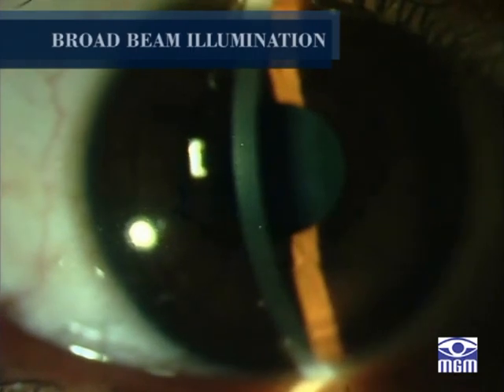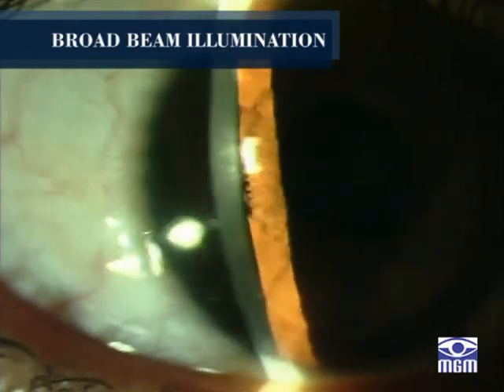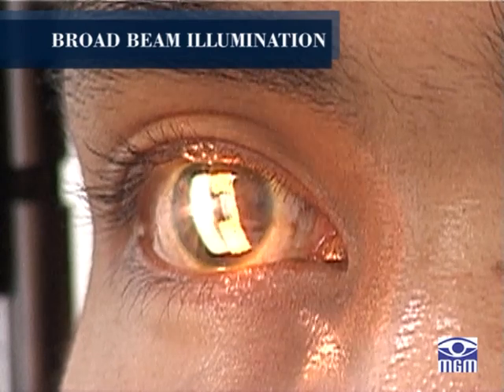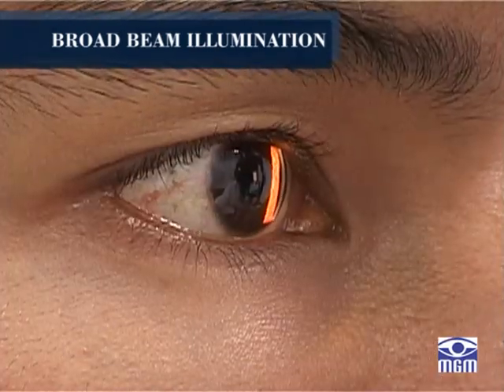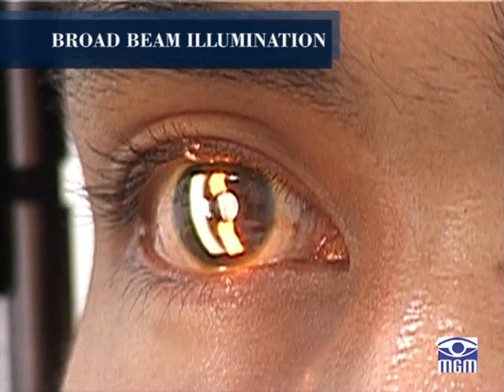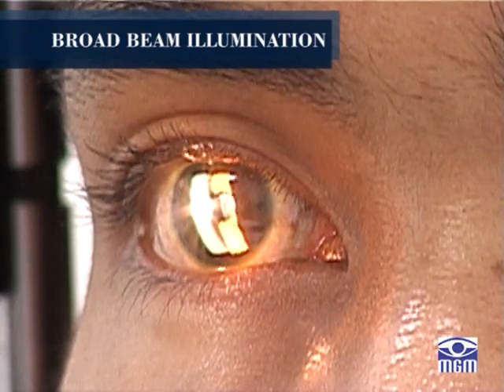Broad beam illumination, the term broad beam is variably used. Here, the beam width can vary from a width of 1 mm to its full size of approximately 11 mm. Here, the beam is intended only as a source of bright focal illumination, and the width is adjusted to maximize the information within the area under study.